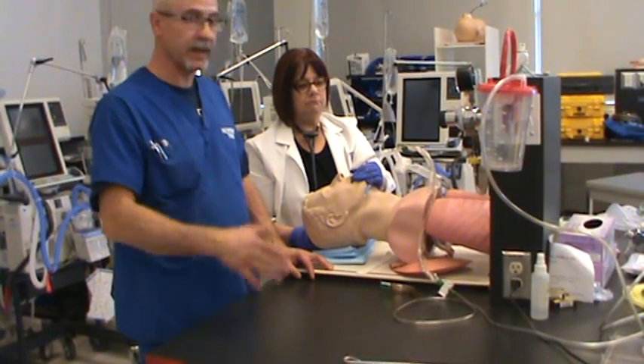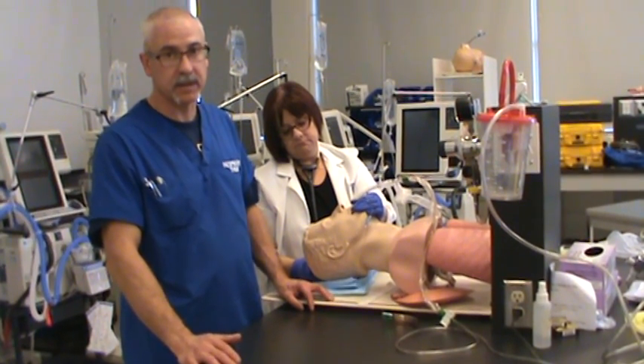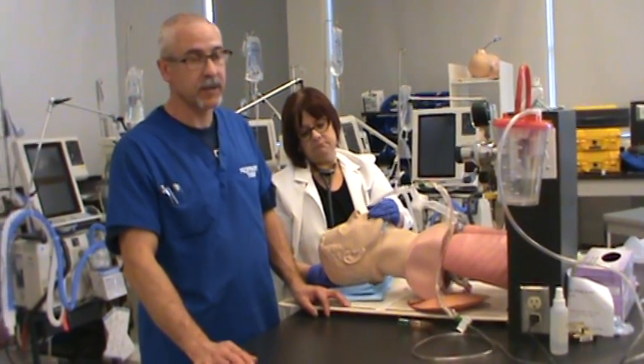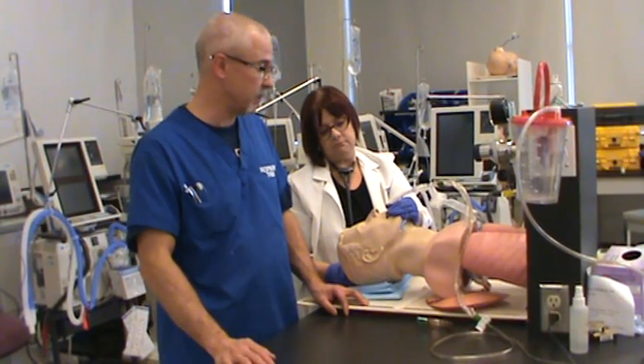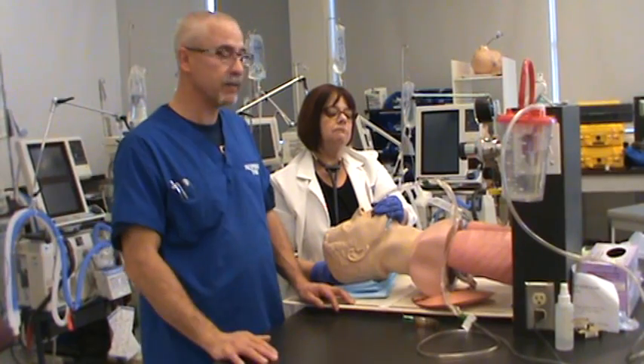If you have to adjust for things like a beard, you can double-side your tape if you need to, or use a specialized endotracheal tube holder if there's a lot of facial hair and you can't shave it off. But in this particular case, we're good to go. The patient's clean-shaven, we can tape the tube in.